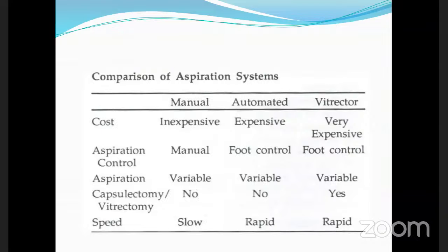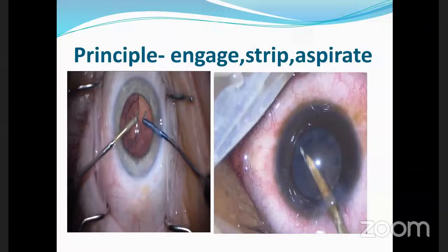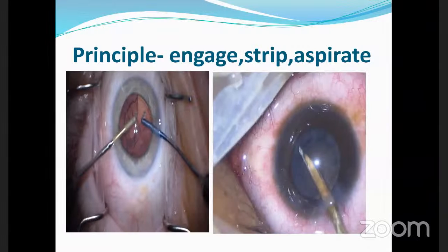Whenever you are aspirating the cortex, always remember to maintain the chamber equilibrium and augment the red reflex, because now the nucleus has been taken off. So in all cataracts, you would be seeing the red reflex. Go in retroillumination, and you can clearly see the capsular margin here, whichever method you have used. And always test for zonular capsular integrity also, because these are complicated cases. You might have accidentally pulled the zonule, or a zonular dehiscence might be there. So check for this before starting the aspiration. And focus should be just posterior to the capsular line.